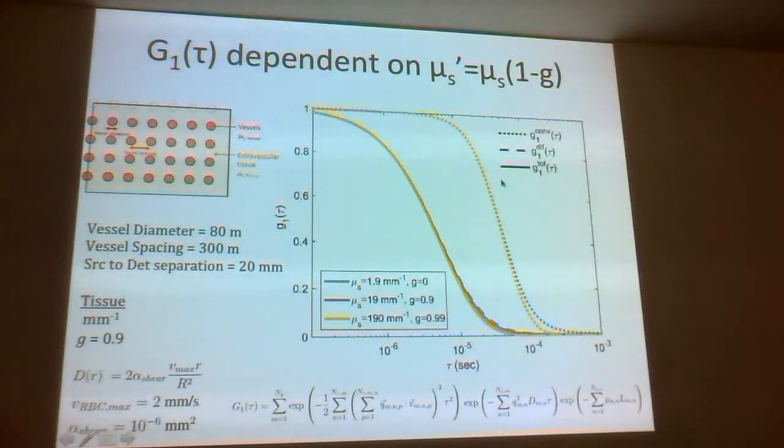It's true for the Monte Carlo simulation, I had that translational symmetry, which made the simulation much easier. But we placed the source and detector transverse and parallel to the vessels, and the results were nearly identical. There was a difference, right? Because you would expect a difference if you're scattering along the direction of a vessel versus scattering across a vessel. So we did see a small difference, but it doesn't really change the results I'm describing. There was no angular anisotropy in different directions. There was a very small effect, but it was insignificant compared to this major effect.